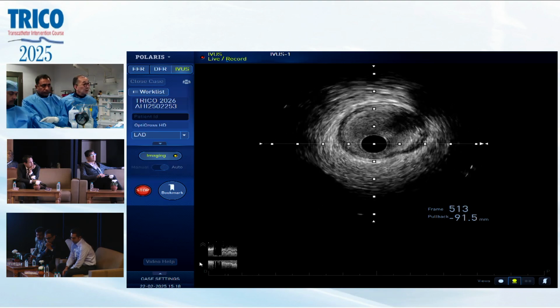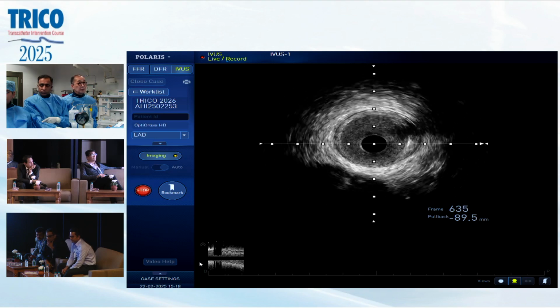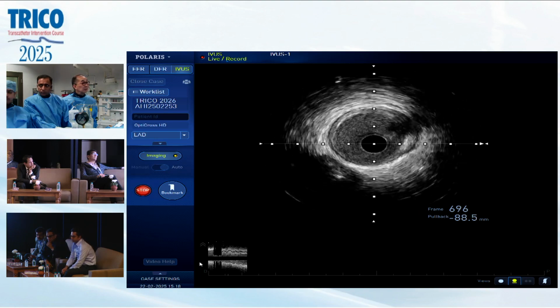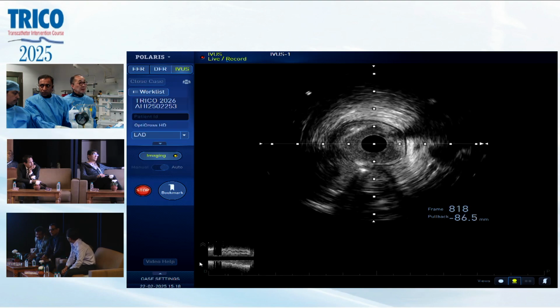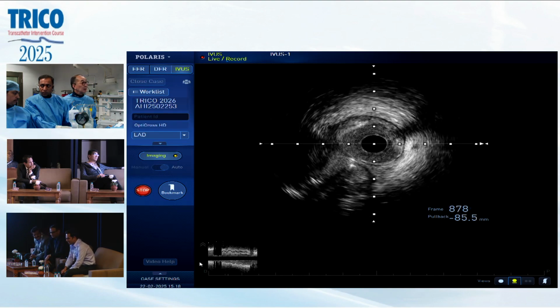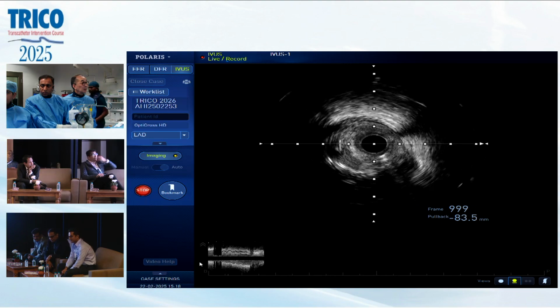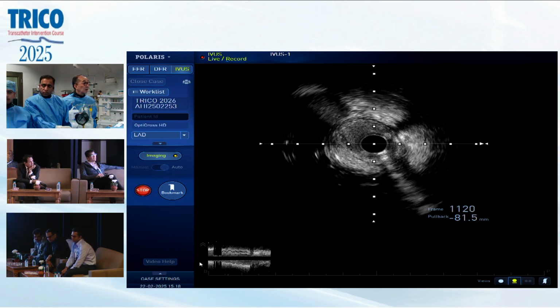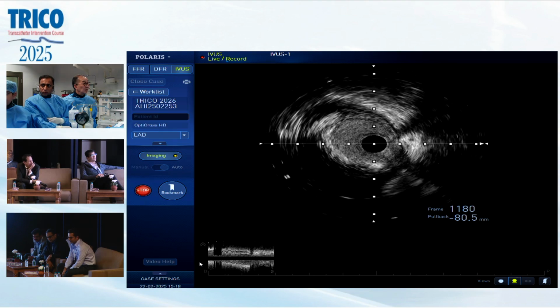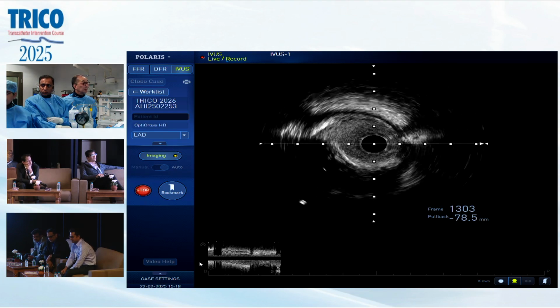The diameter is 2.75, right? No disease, nearly 3 in the diagonal. And coming to the branch, you can see the guide wire here. Just at the bifurcation, we have disease, right? The diameter here might be more than 3.5, and very eccentric calcium.